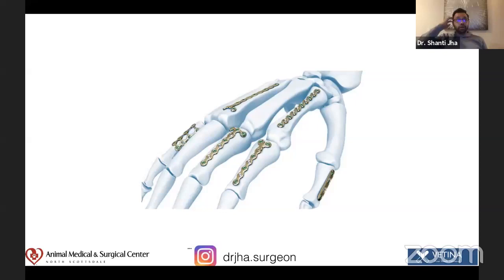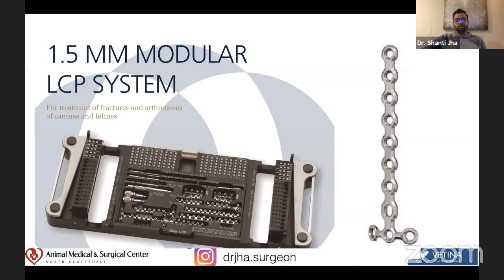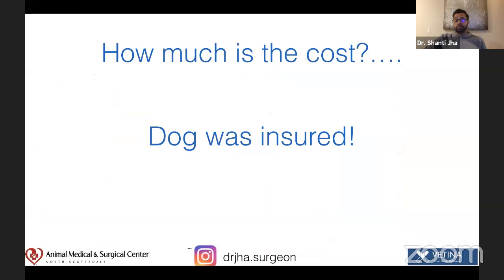So I started looking, this is a small dog, a really small dog. I started looking into different systems and called one of my industry connections here in the US. I said, can I use that finger plating system? Fortunately, the dog was insured. Most of the dogs here who come to see me for a fracture repair cost about $4,000 to $5,000 to repair. I'm fortunate that I work with dogs here that are either insured by smart people, or the owners can pay out of pocket. So I got this 1.5 modular LCP system. Normally I place 2.0 systems, so this is one notch down. The total surgery, once everything was said and done with all the repairs, was about $13,000.